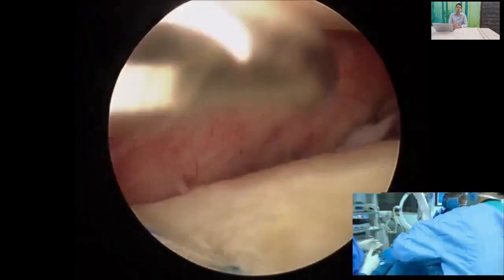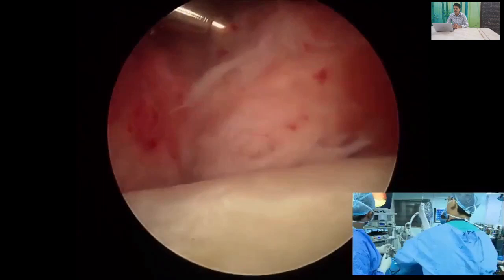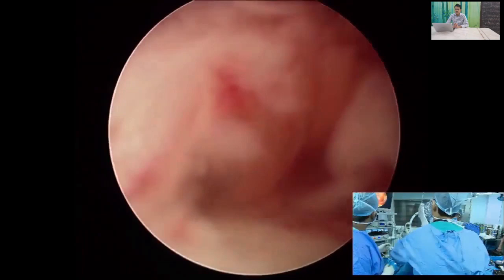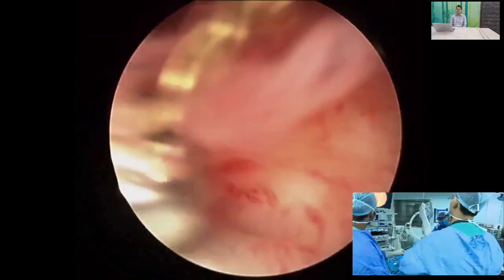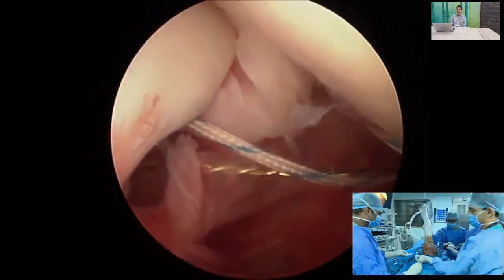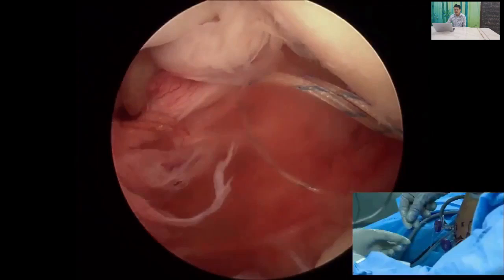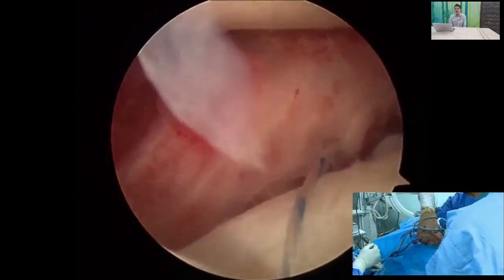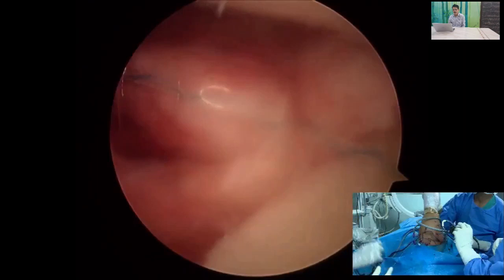Pass the sutures through the capsulolabral complex, exiting inferior to the inserted anchor. Once the tip is visible, the suture shuttle is grabbed by a suture grasper through the anterior superior portal and loaded with the fiber wire. This is pulled through to create a tissue limb. Using this tissue limb as the post, tie a sliding locking knot — specifically an SMC knot — through the anterior portal.